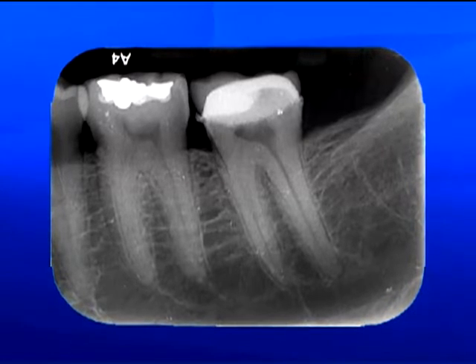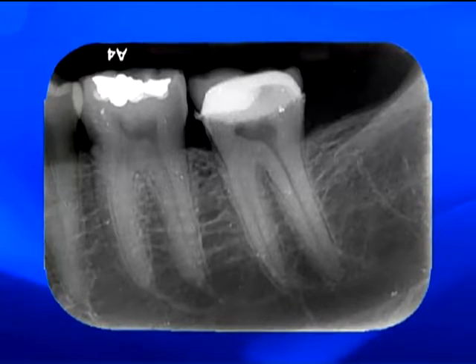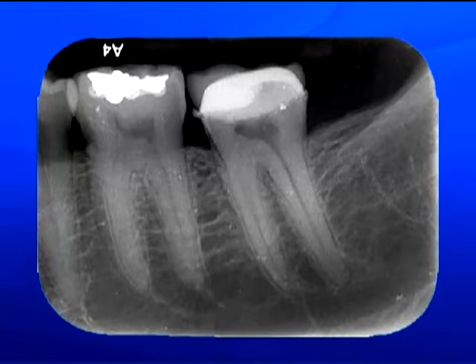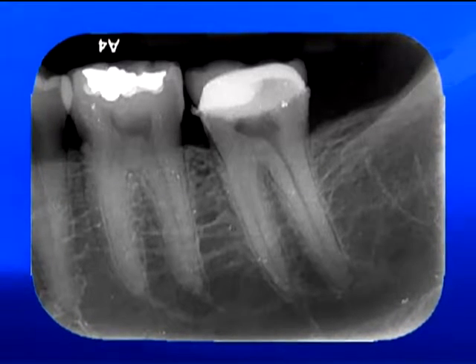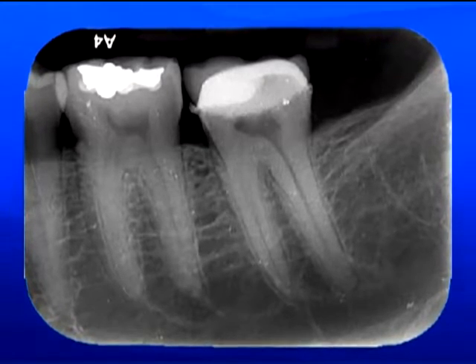Fortunately, GTX files have limited maximum flute diameters, so we will be able to accomplish our apical shaping objectives without worry of over-enlargement. The canals are challenging because of their apical curvature, but the safe tip geometry of these instruments and the landed blades will provide the apical shape we need without fear of transportation.